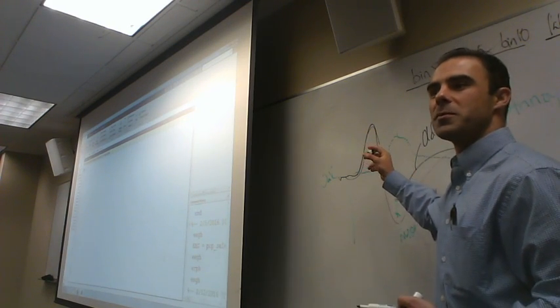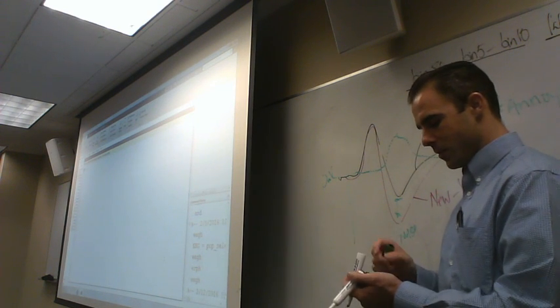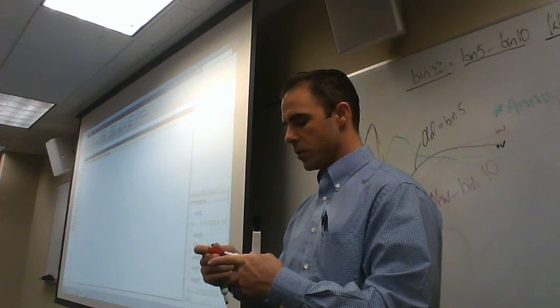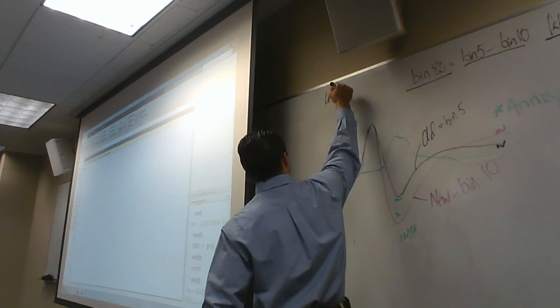Cool. And if you notice, it looks pretty substantially different from our regular ERPs. And so that's the idea there. And the second part, of course, you would use events list as a text file first, because our order of operations is, we're loading in the data.